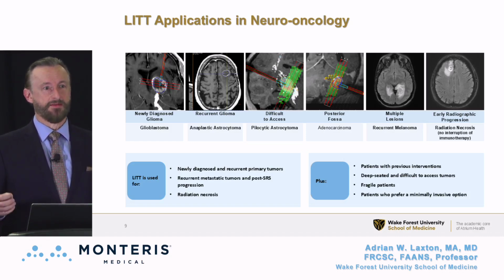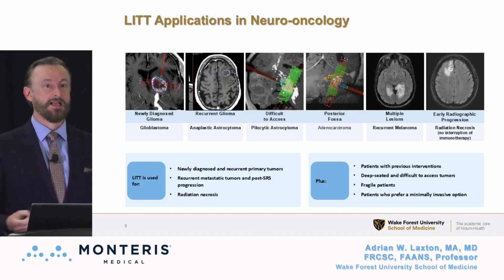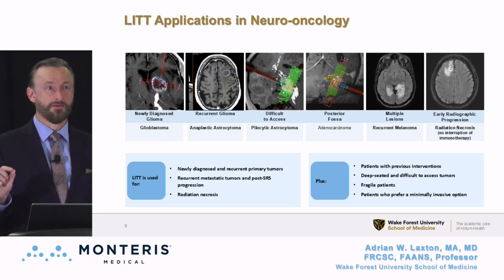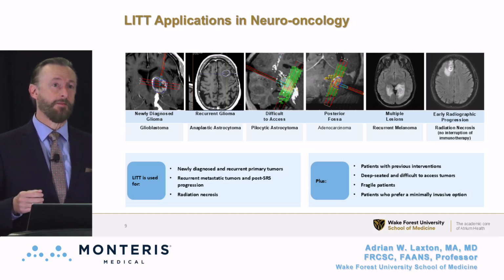Also, because of the minimally invasive nature of the procedure, patients who are otherwise frail, perhaps on other systemic therapies, and the smaller you can make that incision, the better. Maybe they've had whole brain radiation before or something, and you're concerned about wound healing and infection, and then having a quarter of an inch incision versus a several centimeter incision may be relevant to that patient. And then of course our patients are on all sorts of different chemotherapies and other types of immunotherapies, and this minimally invasive approach can allow ongoing therapy for that patient, whereas perhaps with a larger craniotomy you might think you'd need a 1 or 2 week window where you stop those therapies. It's an example of that.